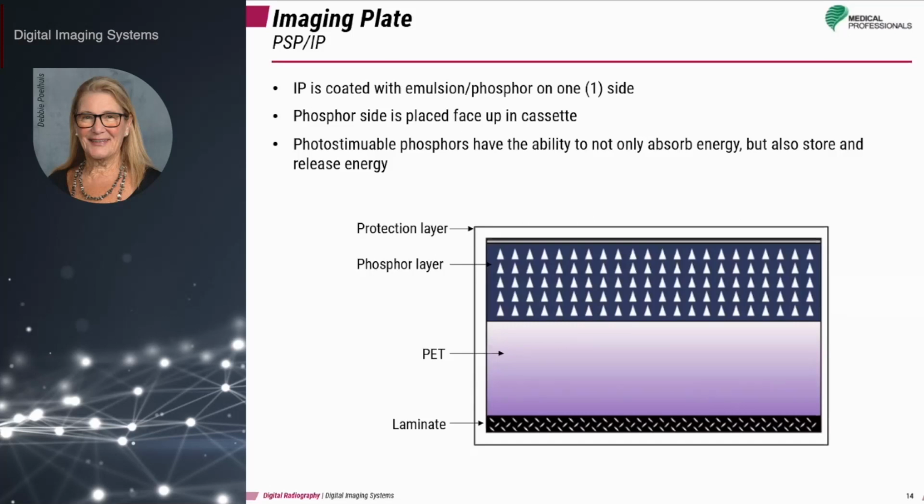The phosphors must have the ability to absorb energy, store energy, and release the energy upon proper stimulation or excitation. Certain barium fluorohalide compounds exhibit these types of characteristics.